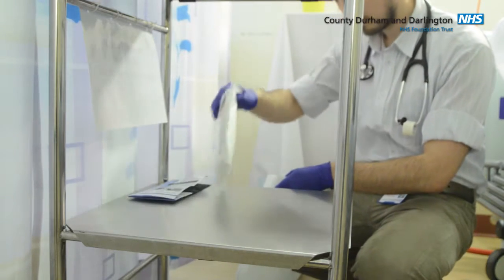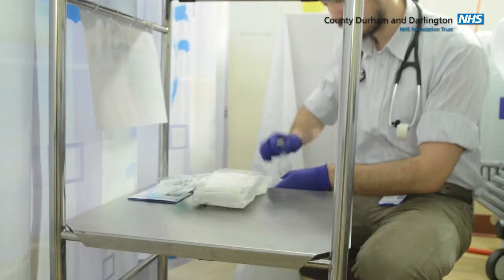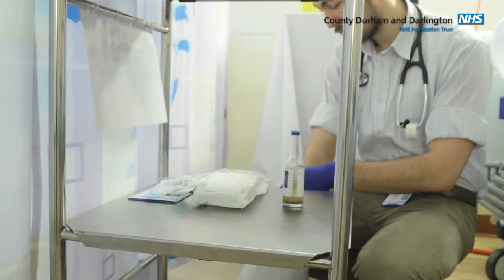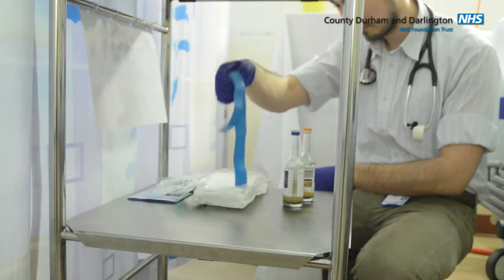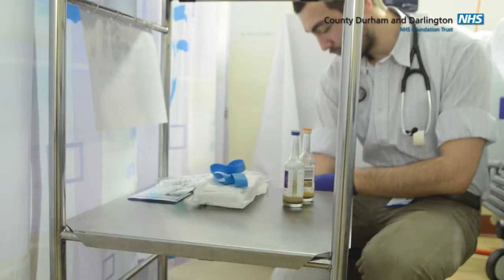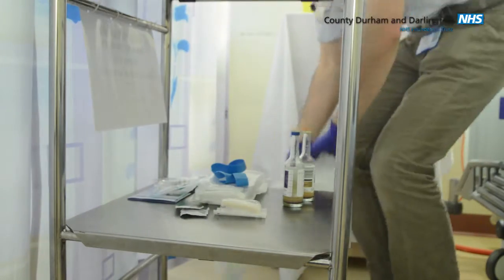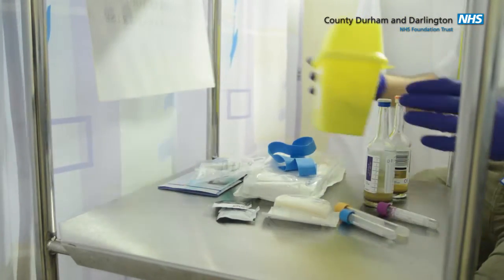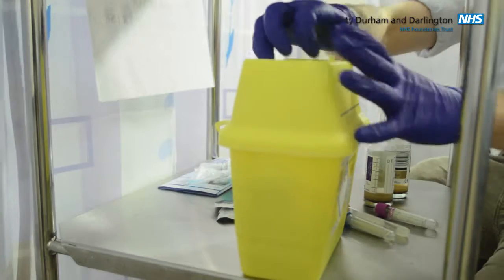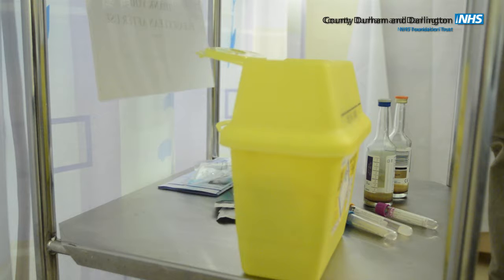That's the instruction pack should you need some extra help, a dressing pack, a safety butterfly vacuum system, the blood culture bottles themselves, a tourniquet, a Chlorprep for cleaning skin, and finally 2 green Clinell wipes, which are used for cleaning the necks and tops of the bottle. Additional equipment will be required if you need to take extra blood samples, and finally a sharps bin. Open the top of the sharps bin so it's ready to take the sharps once the procedure is finished.